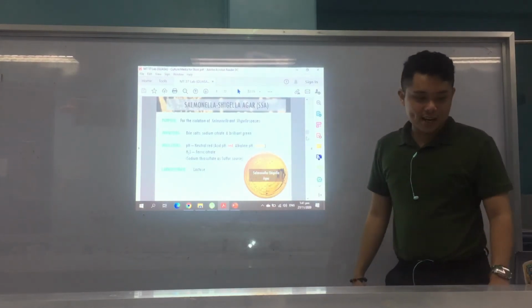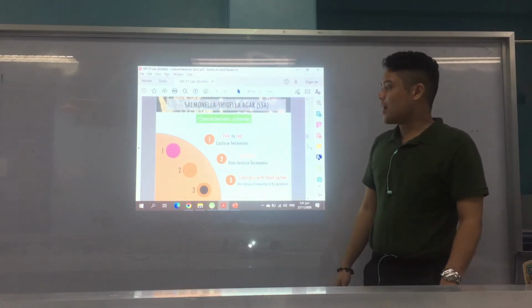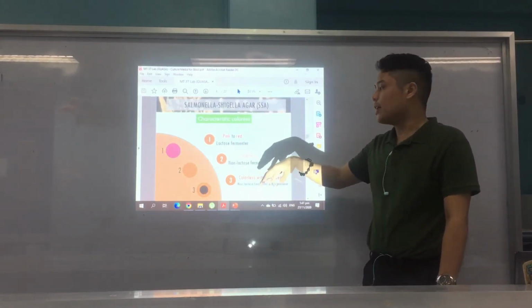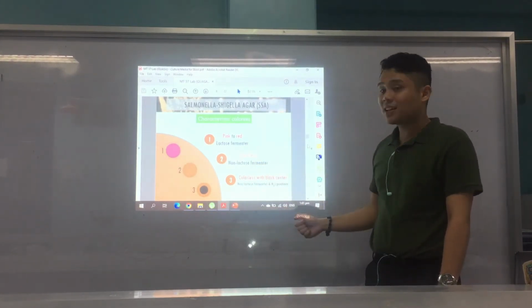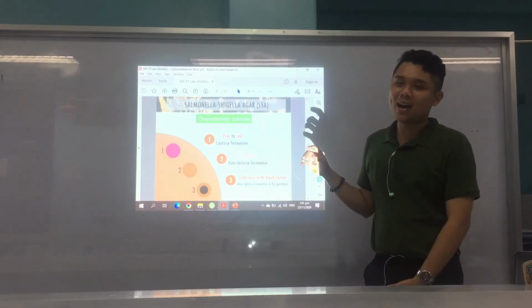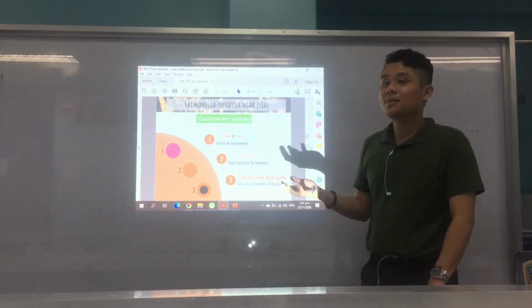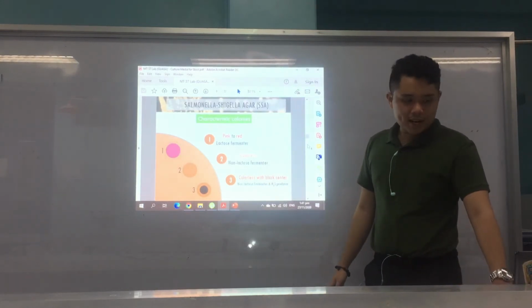Okay, Salmonella Shigella agar. And what are the characteristic colonies? Pink to red is a lactose fermenter, so other members of your enterics. Colorless, non-lactose fermenter. And last, colorless with a black center, non-lactose fermenter and H2S producer. You get it, usually if there is black, or blackening, a black center, whatever, that signifies that the organism produces H2S. So who are the lactose fermenters?